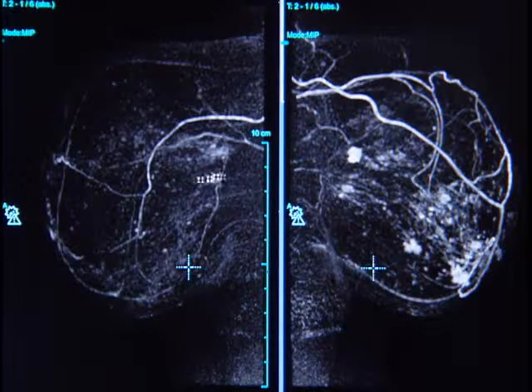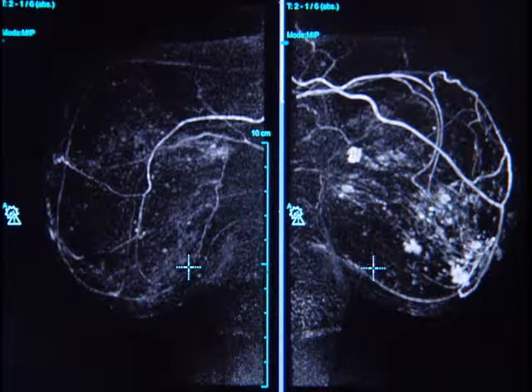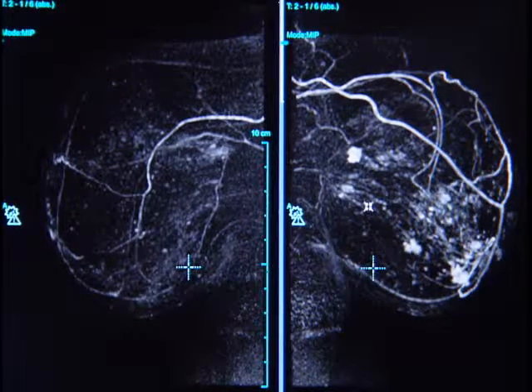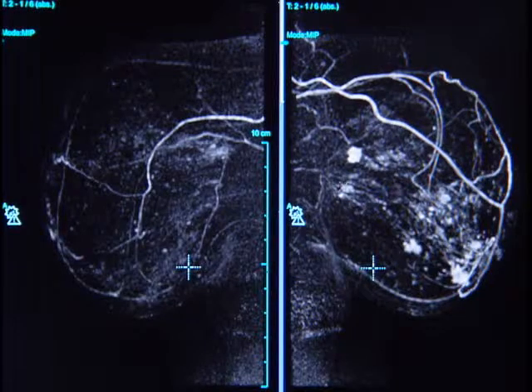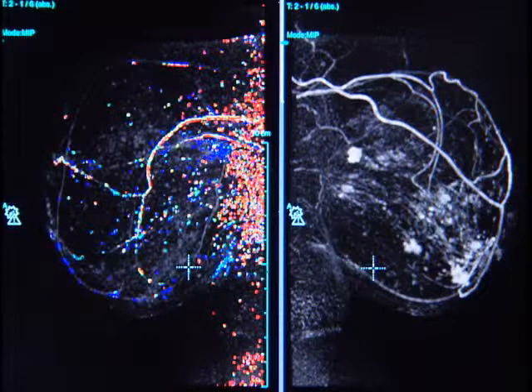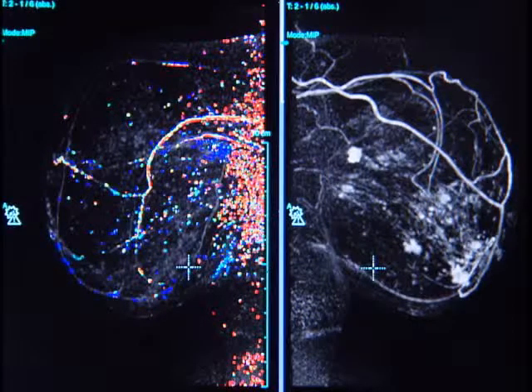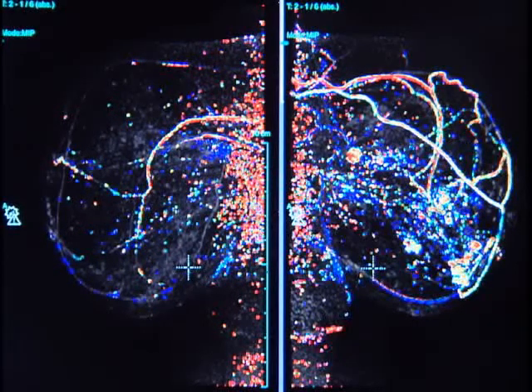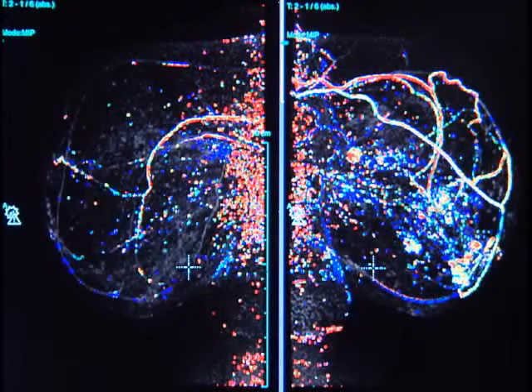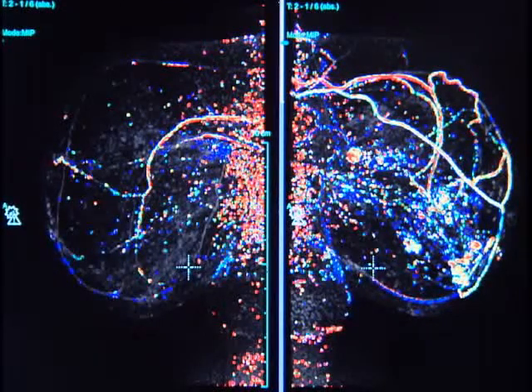You can see, in this case, the obvious asymmetry with multifocal areas of abnormal enhancement with speculated margins. Again, color parametric mapping can be applied to both of these abnormalities. And although there is some background noise, you can see that these areas in the left breast demonstrate high-threshold enhancement with washout kinetics.